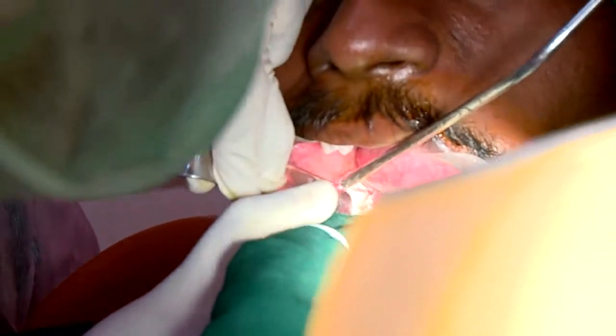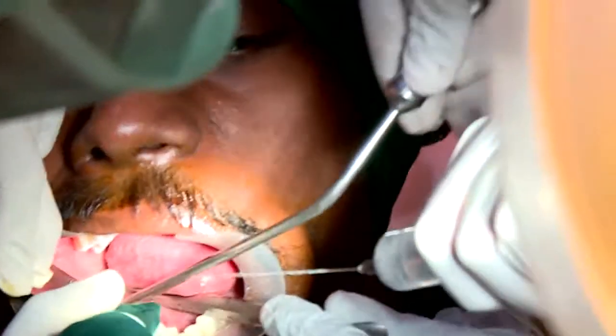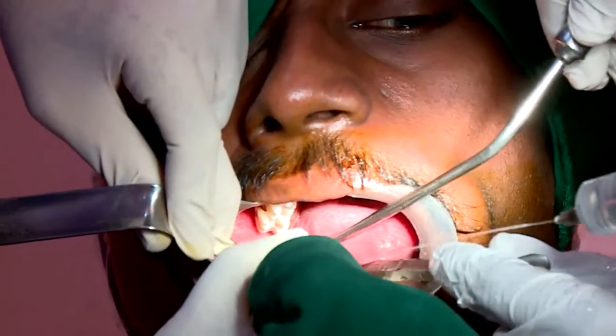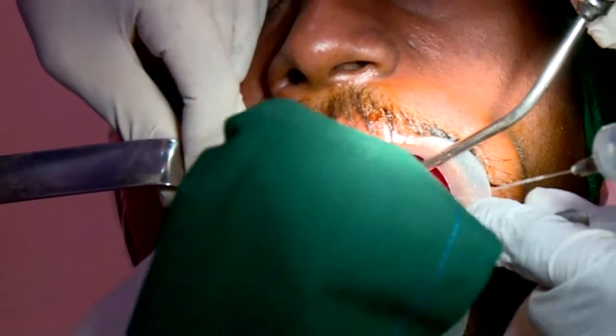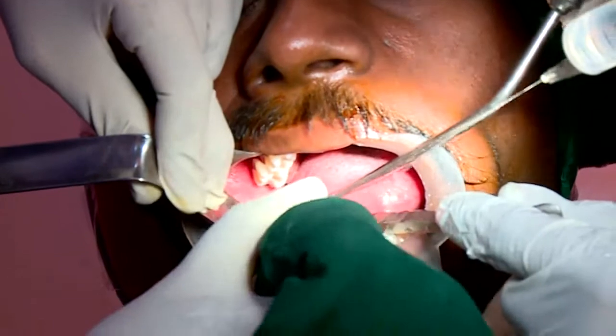Can you see the bleeding now from the marrow? You can slowly do the procedure.